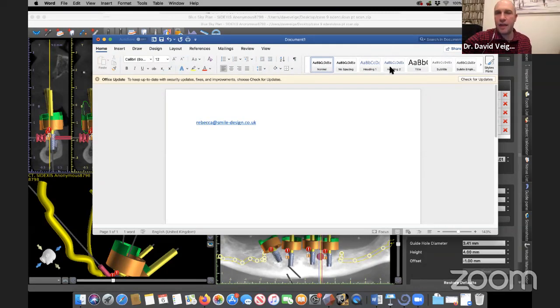Thank you for your nice, another question. Thank you for your nice and knowledgeable presentation. If I may ask a couple questions. What type of material have you used for your final restorations? Are you with less implants and distal cantilever or pterygoids and zygomatics?